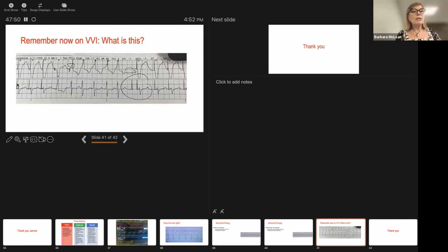So now I look at this, I say spike response, spike response, spike response. Not sure, is that an atrial pacer? And is that atrial pacer still firing even though you reprogrammed it to VVI? I need EP. My patient needs EP, and I mean now, not tomorrow, not later. Talking to my APP, they say, don't worry about it. No, I'm really worried about it.